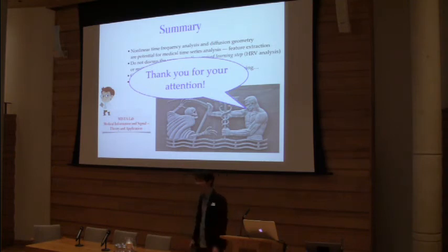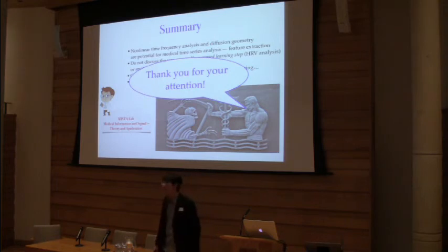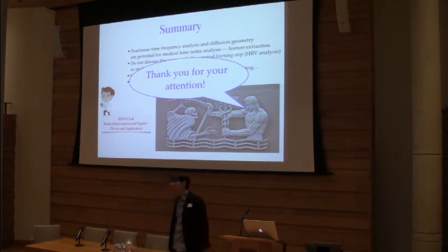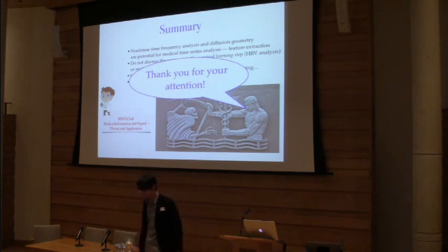Does the relative frequency of the maternal heart rate influence the accuracy of the detection? Right now, no. But in the first paper, we considered the scenario where the mother has VPC, or the fetus has VPC, and how accurately we can recover the signal. The answer is yes, it will impact the final result, but it's not very sensitive to it.